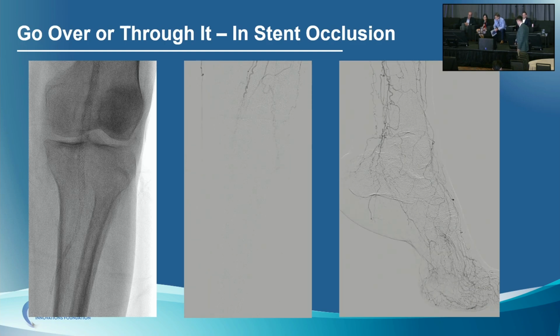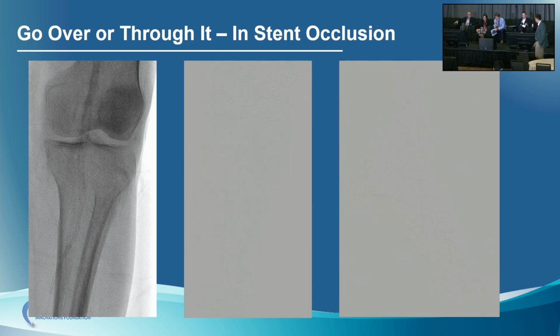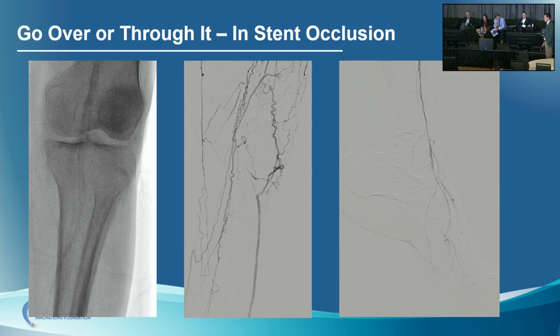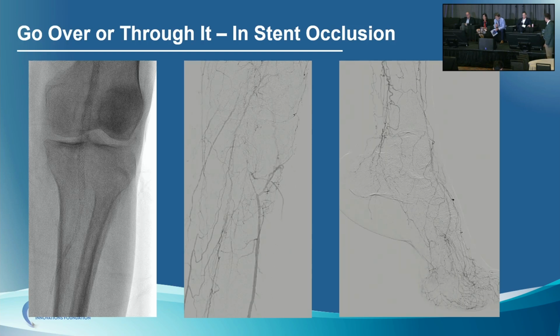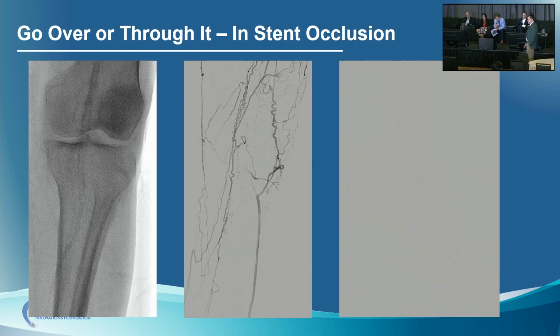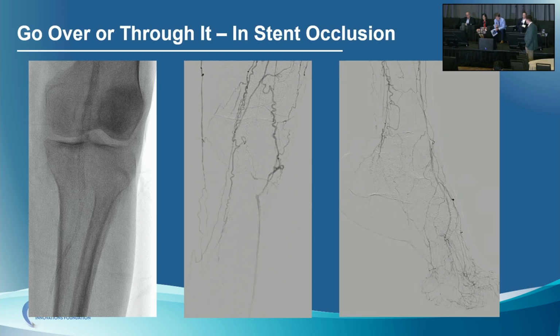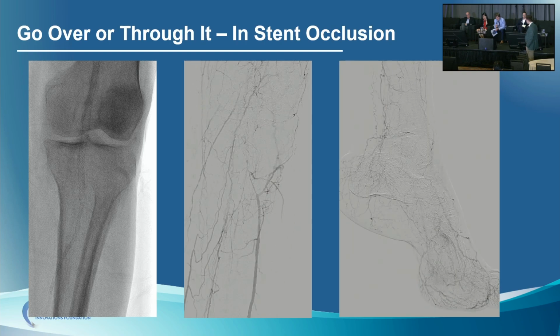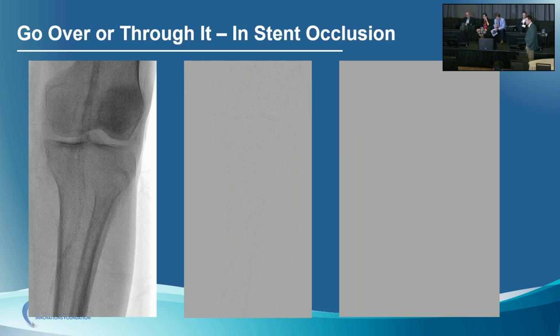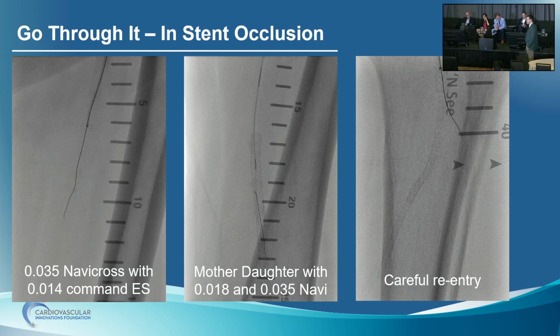Right. And unfortunately, it was not. Unfortunately, I don't know who did it, and we weren't there. But somebody stented across the best vessel she had. Correct, the anterior tibial. You probably could still go retrograde and get there, and probably still could fix this, but it's a shame that you got these long stents, including some pretty small ones in the TP trunk and posterior tibial. Maybe they left that magic hole between. There's a little tiny gap there. I doubt it. But we've stented across the best vessel she had.